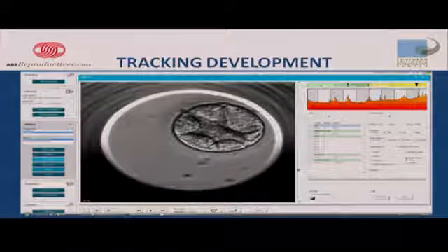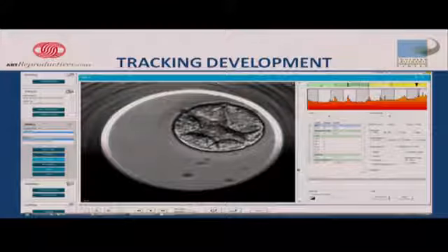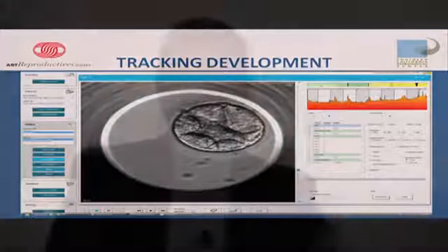We sit there with the embryos in the EmbryoScope. We look at them all individually, and on the right-hand side, you sort of see this orange, green, yellow, orange bar that goes up and down. That helps us track when major changes have happened. As each one of those bumps goes up, it's telling us that it divided or did something during that period of time. And we concentrate on those changes and divisions, and we track them, and we can rank each thing that happens, each 2 cell, 3 cell, 4 cell. By doing that, you get all the time points of how long it stayed at each one. And those become important when determining what are the best embryos.